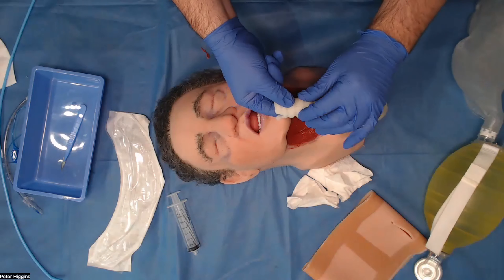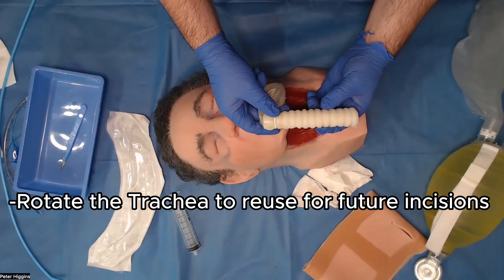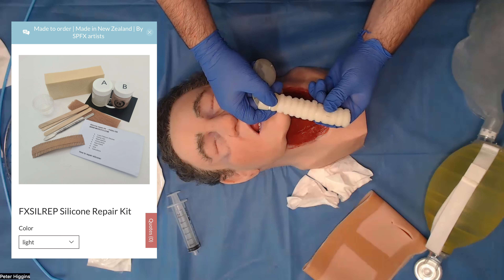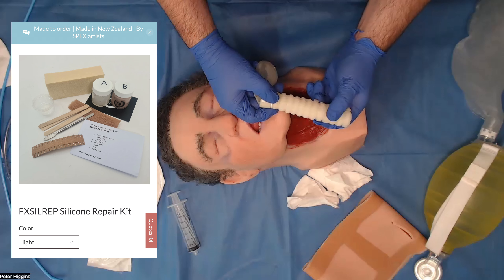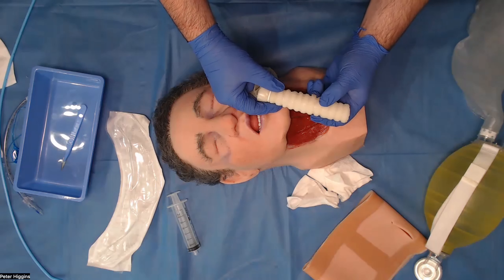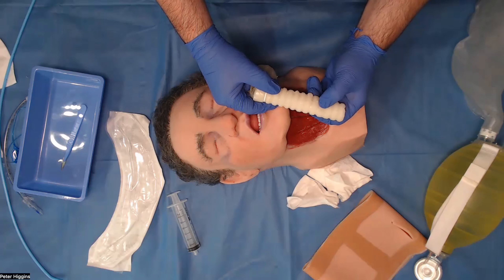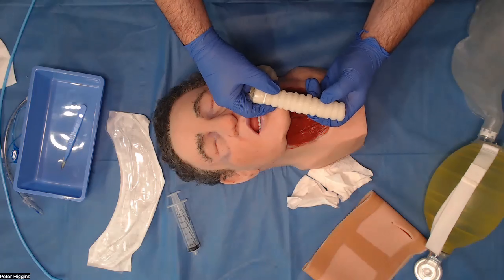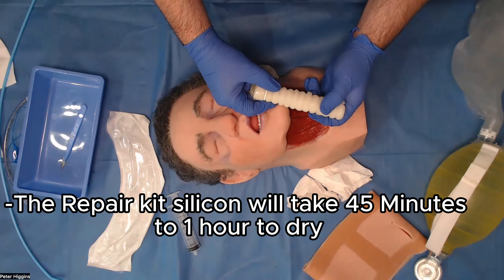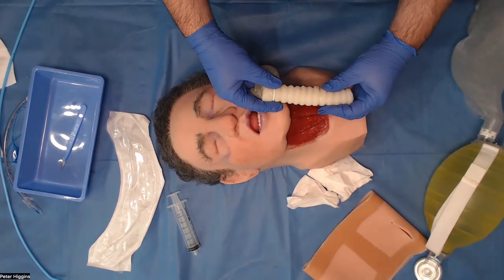To give you longevity of this model, you're very welcome to turn the trachea around. With the repair kit, if you're concerned that you'll get a bit of air escaping on ventilation, then just pop a bit of silicone over here and leave it somewhere to dry. If you're concerned about time, you're welcome to use a hairdryer to speed that process up. It should only take about 45 minutes to an hour to be in a usable state. Swap the balloon end around and you're good to go.